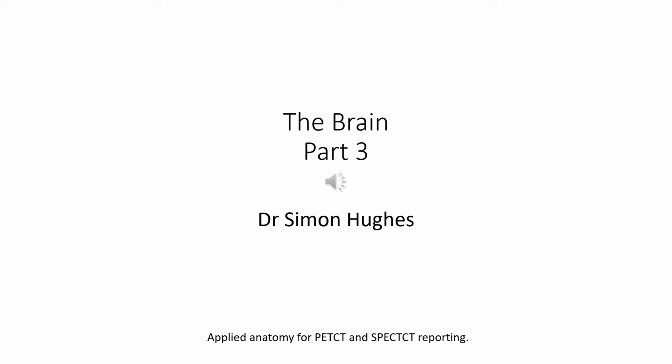This is part of the Applied CT Anatomy course for PET-CT and SPECT-CT reporting.